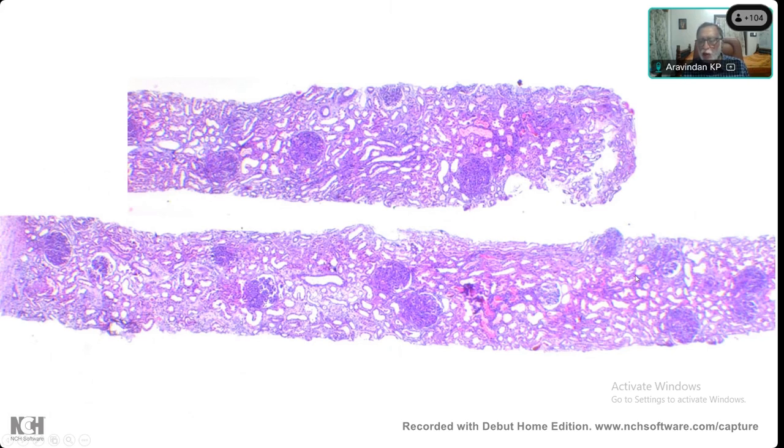What do you think about the tubulointerstitium? Sir, tubules are back to back arranged, so you think these are normal? So again, it shows that there isn't much permanent damage. So this seems to be a reversible condition with no progression or permanent damage so far, and with very large and hypercellular glomeruli.